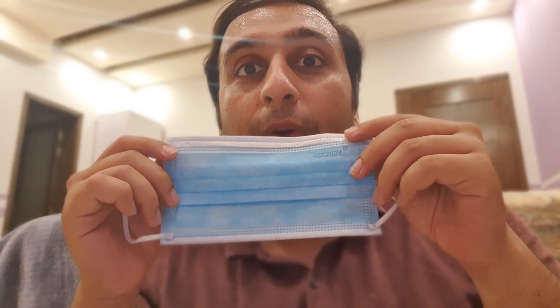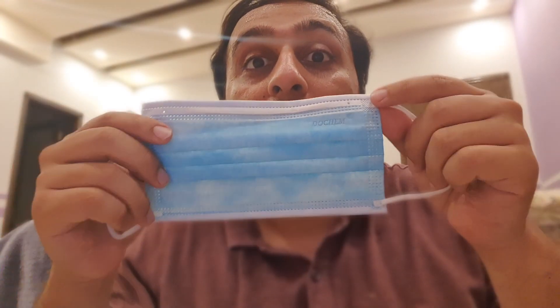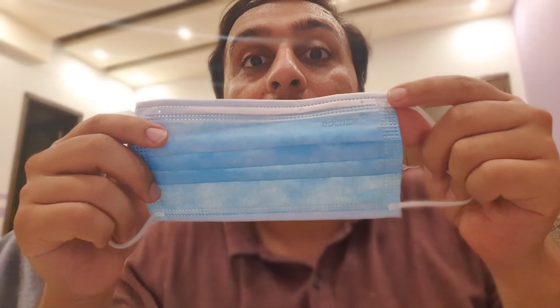One of these sides is the right side to wear outside and one is inside. The correct way to wear it is the colored side should be outside and the white side should be inside. Wear it so it covers your nose and covers your mouth, and if there is a nose adjustment, you adjust it to your nose.